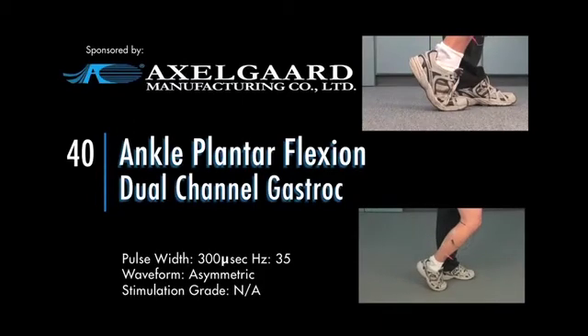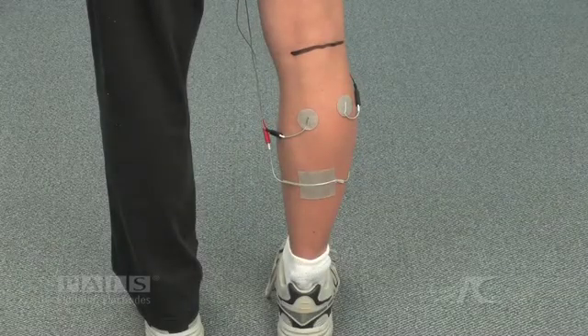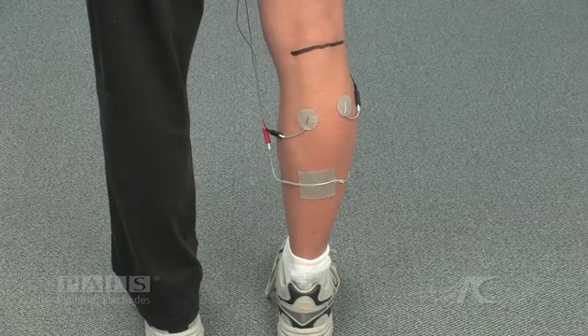Ankle plantar flexion, dual channel gastroc. Electrode placement for plantar flexion stimulation, dual channel activation of the gastrocnemius muscles.